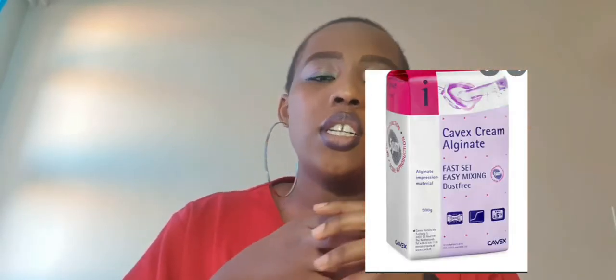The primary agent in alginate is potassium alginate. The main ingredients are seaweed and kelp, which are normally found around the coast of Japan, overseas. That's the primary agent that brings about this 3D structure, and from there a retardant is needed. From this powder that you see as alginate, a retardant is needed, because if you just use potassium alginate as it is, it'll basically set before you even put it inside the patient's mouth.